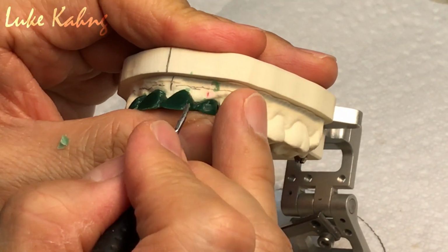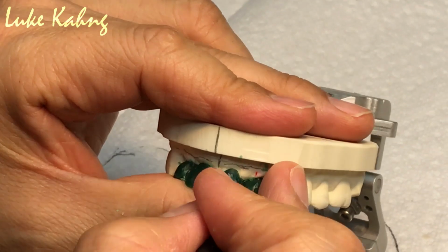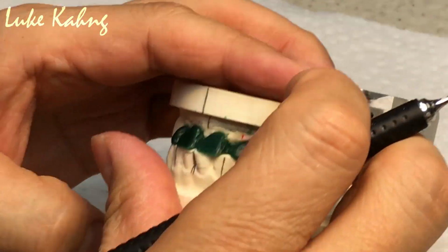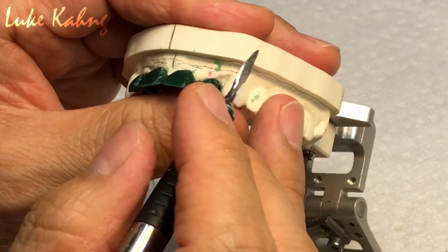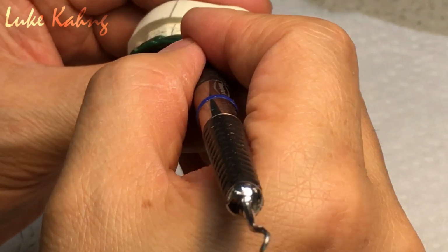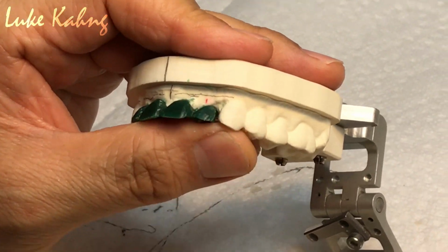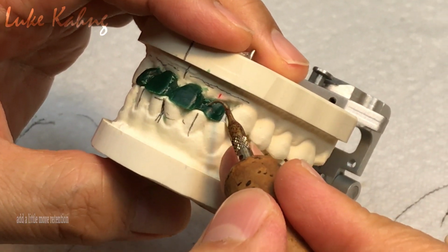Now I can try to get a little bit of roll in, to thicken, because this is a metal, right? It's not zirconia. So I have to cut it a little bit more like that. Now, once I'm done, this is too small and fat because it's already the same. I don't want it. Just grind it. That's what I need. And then you have to add a little bit more embrasure and more retention.